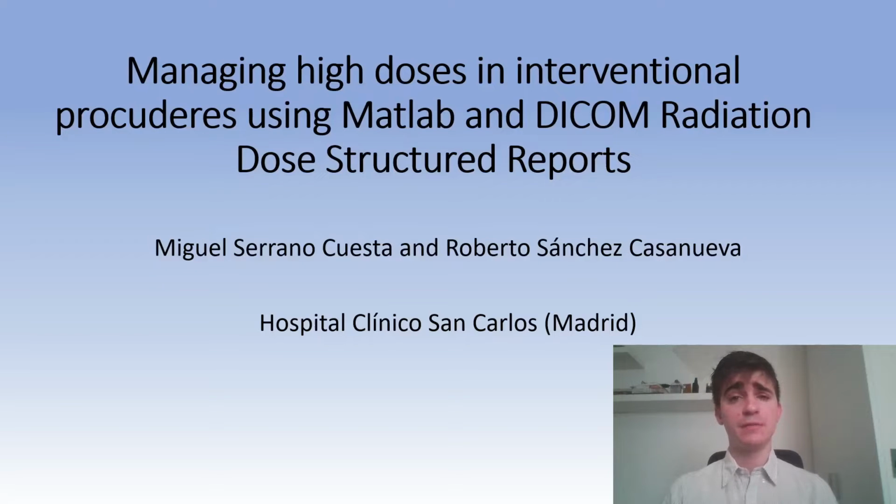I'm a resident of medical physics in the Hospital Clínico San Carlos in Madrid, and I'm here to defend my abstract for the do-it-yourself fair, which is called Managing High Doses in Interventional Procedures using Matlab and Dicom Radiation Dose Structure Reports. First, I'm going to show a video where you will see DIDO, which is a software called Dicom Dose, which is able to estimate a 2D dosimetric map and the peak skin dose of an interventional procedure. This software was programmed by Roberto Sánchez.